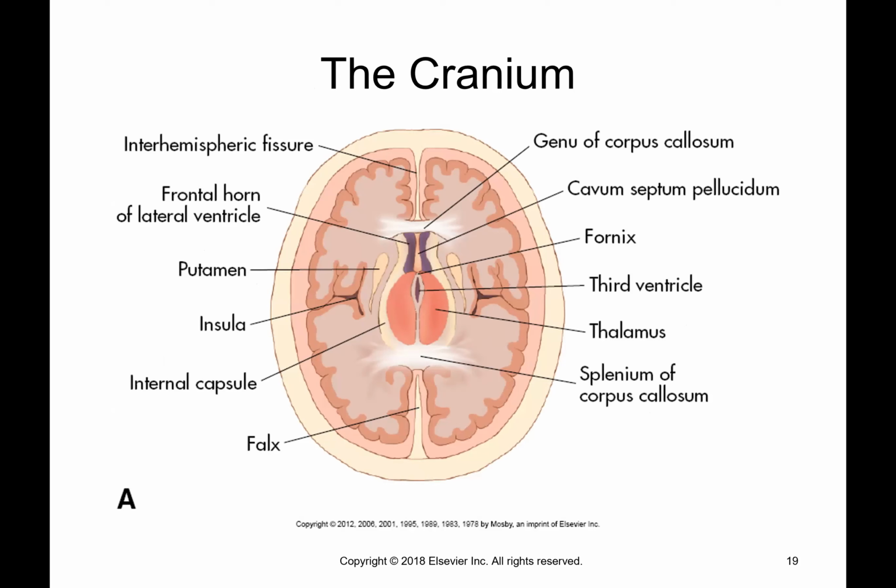We also look at the thalamus, which is in the middle here, and I think it looks more like a heart to me when we're scanning. It's a very important landmark for us. We want to see that. We want to see the cavum septum pellucidum, which is like this little box looking thing. That's an important landmark for us also to see.